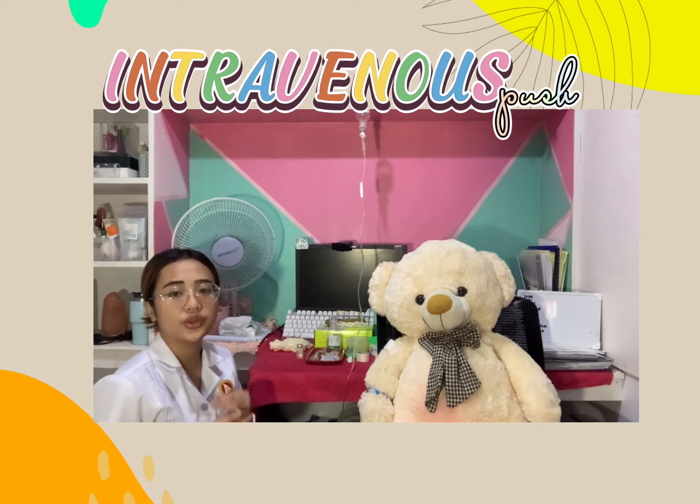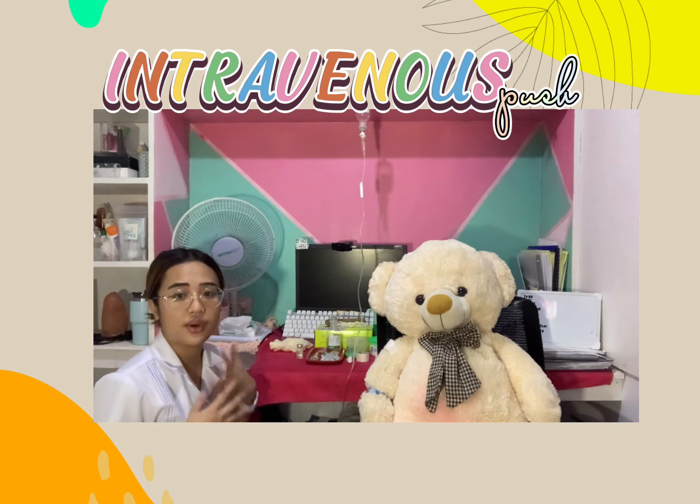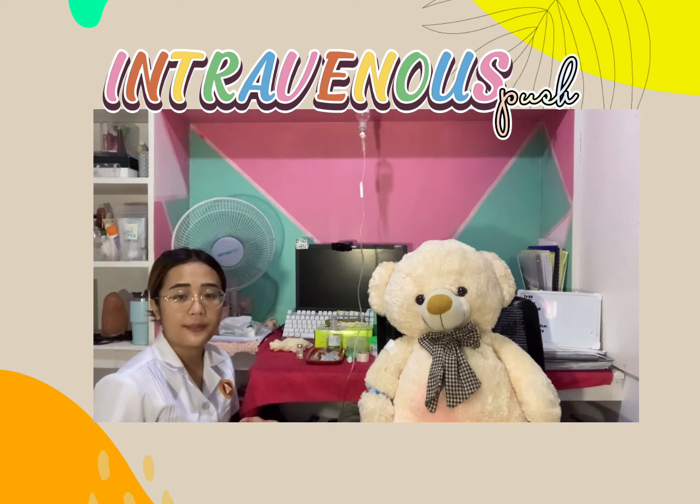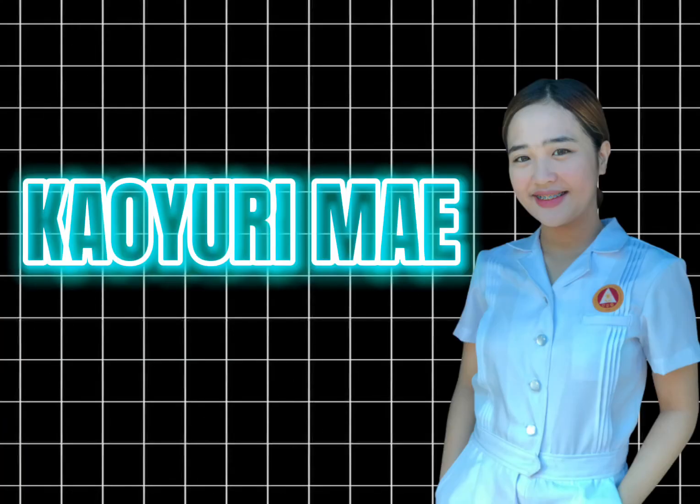Also, we need to document if there are any untoward reaction of the patient, and we need to document the effect of the medication to the patient. So that ends the administration of IV medication via IV push.